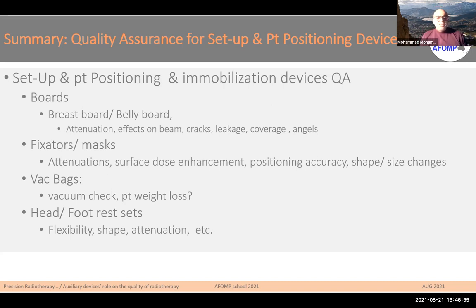Fixators and mask: attenuation, surface dose enhancement, position accuracy, and changing of the size during the treatment. Vacuum bag: patient weight loss and gain, vacuum check, and head and foot rest. You can see the flexibility, and changing of the shape because of irradiation and attenuation should be taken into account.